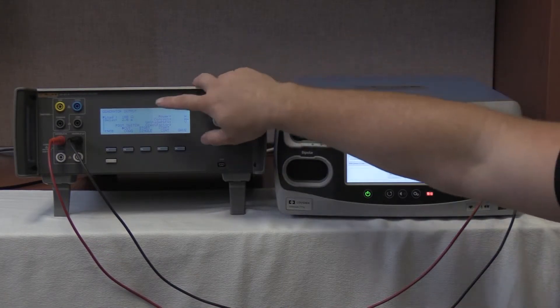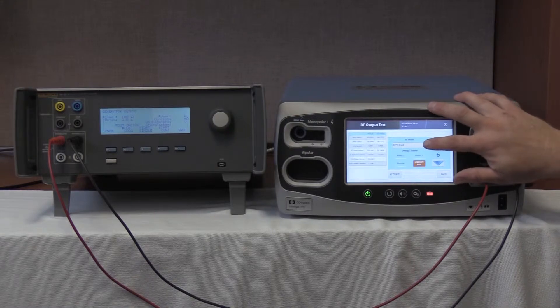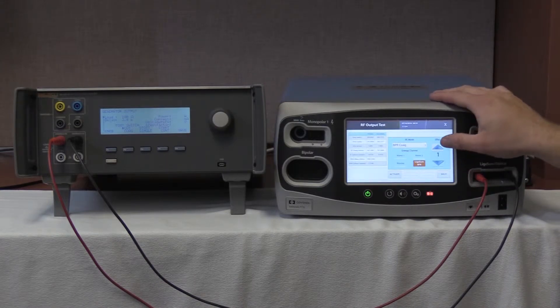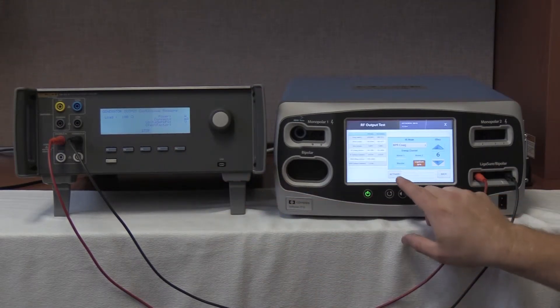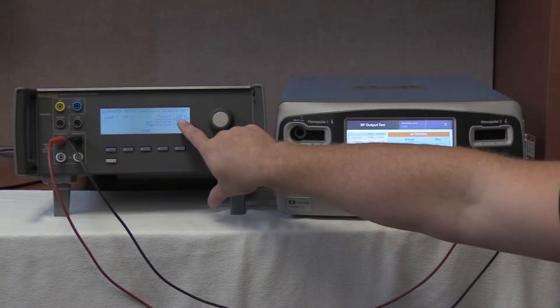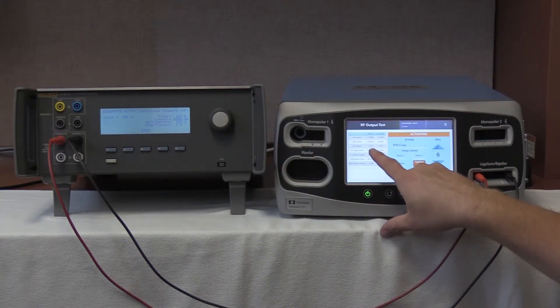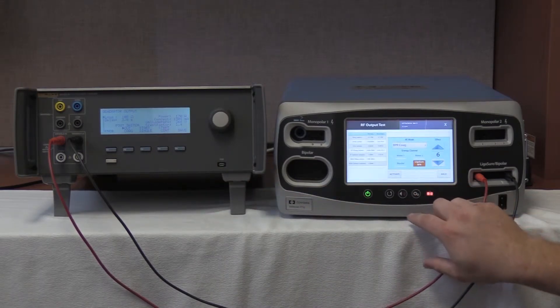We are now going to select 100 ohm load on the QES3 and select bipolar resection coag on the FT10 by pushing the RF mode button — BPR coag — then Effect 6 for our power setting, and push the up button. Start continuous on the QES3 and activate on the Valleylab Covidien FT10. We are looking for 1,145 to 1,538 milliamps. We have 1,301 milliamps reading on the QES3 and 1,315.6 milliamps on the FT10. Stop on the QES3 and push deactivate, holding all values on the FT10.